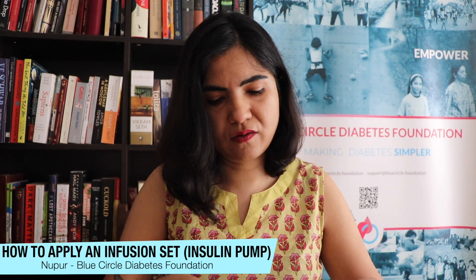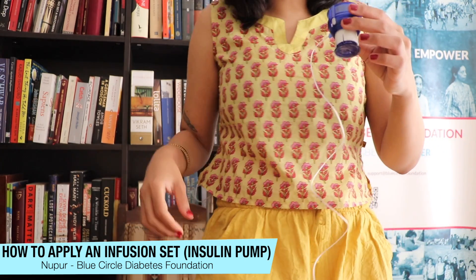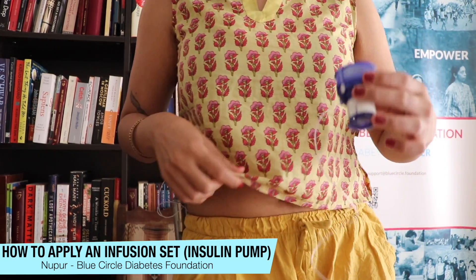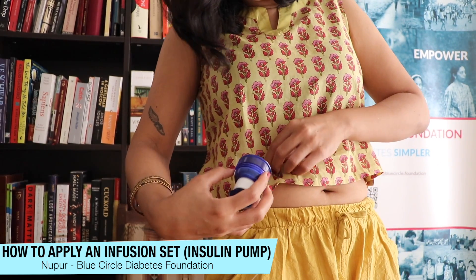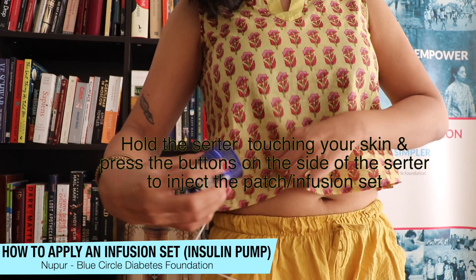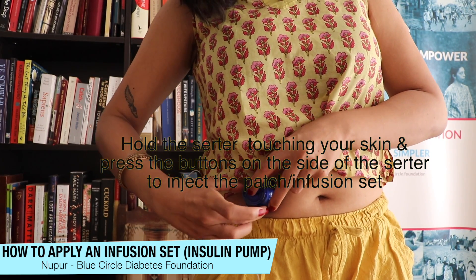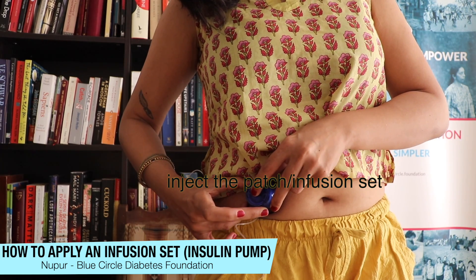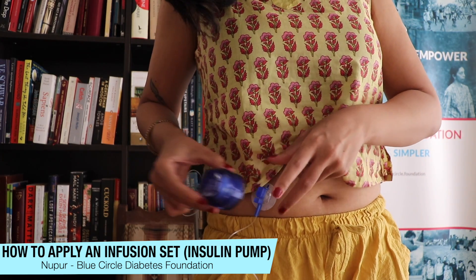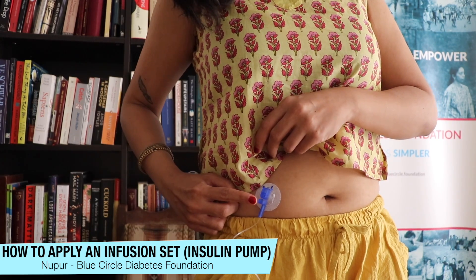I've already cleaned my site, which is going to be my torso. I'm going to apply this onto my torso very quickly. You can see my patch right here — I'm going to apply it on my body like this. If you listen carefully, there's a little noise that indicates your patch is applied. You push this down and then you remove it.